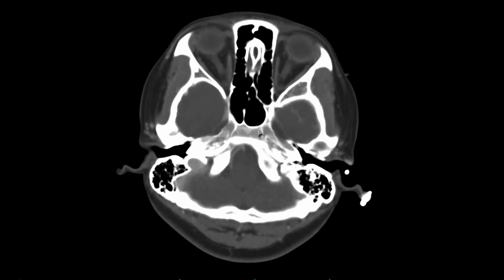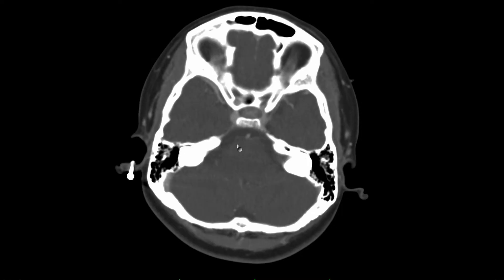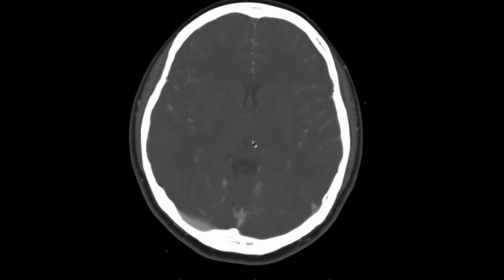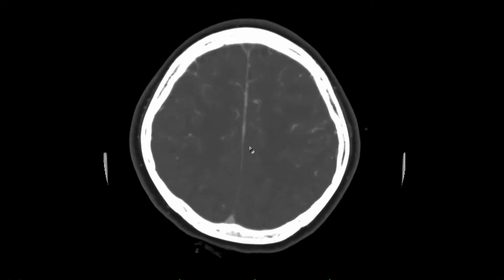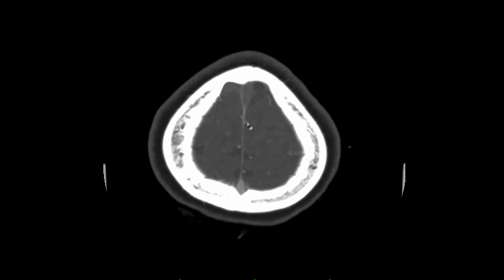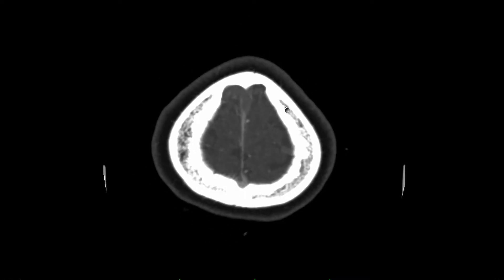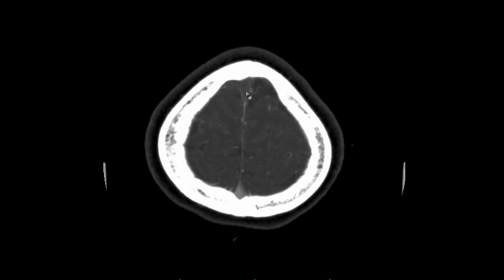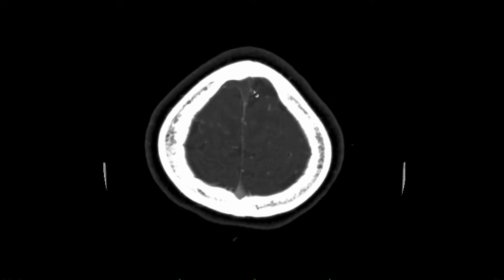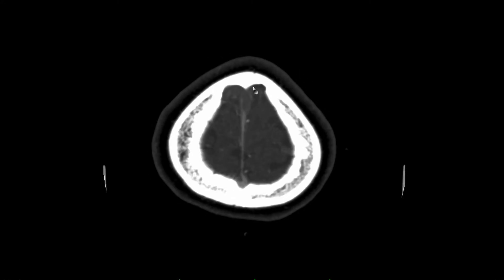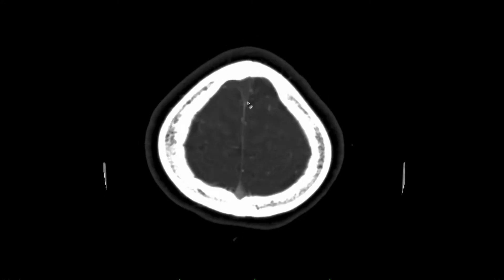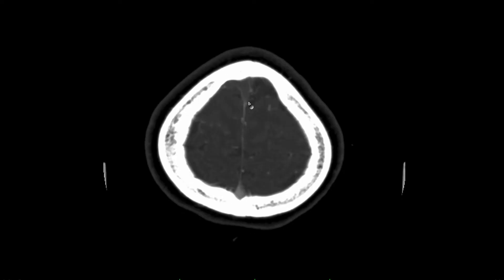That was what was performed, again starting at the skull base and scrolling up. In the region of abnormality identified on the non-contrast brain, you can see that the dural venous sinus anteriorly is non-opacified. It's also expanded. There is an empty delta sign. All of this fits together with the diagnosis of dural venous sinus thrombosis in the superior sagittal sinus.